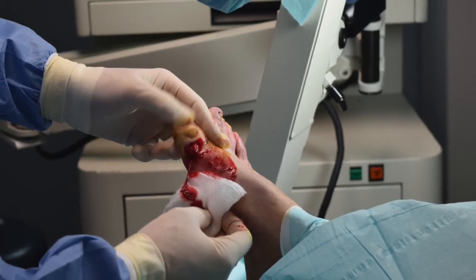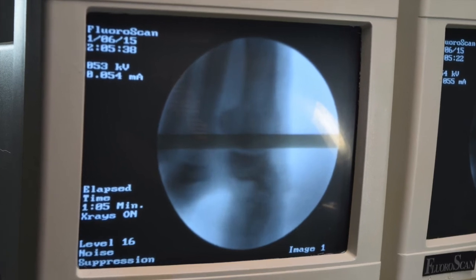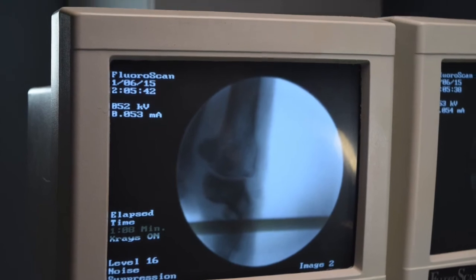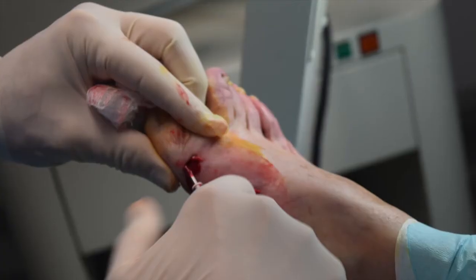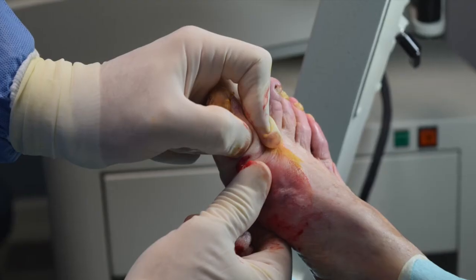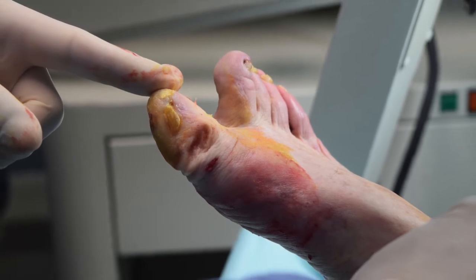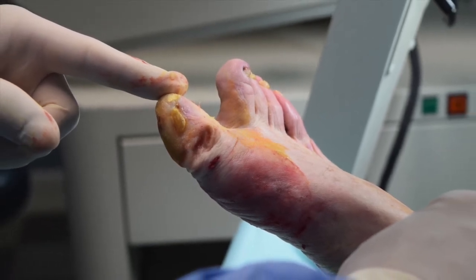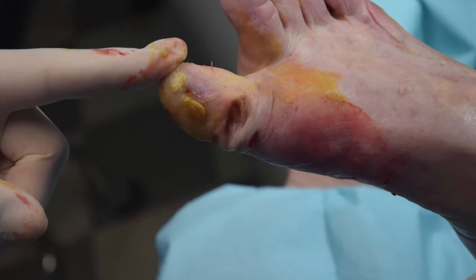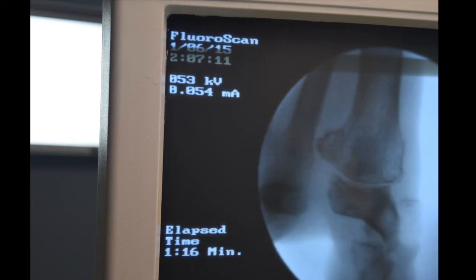We did this all under the C-Arm. This is the removal of that infected bone and you can see how involved this infection is in the hallux. We cleaned all that up and basically took out the majority of the head of the proximal phalanx and performed a wedge in the remaining bone. This is how the bone looked — you can see most of the bone infection out, the wedge out, and you can see the redundant skin here. We cleaned up as much as we possibly could.